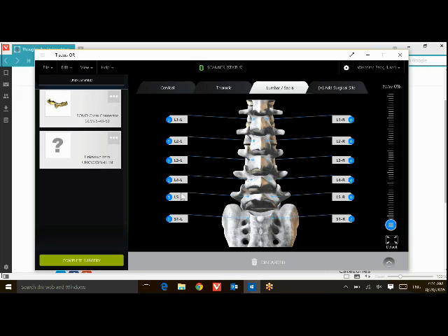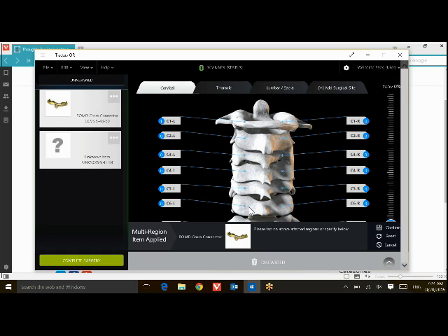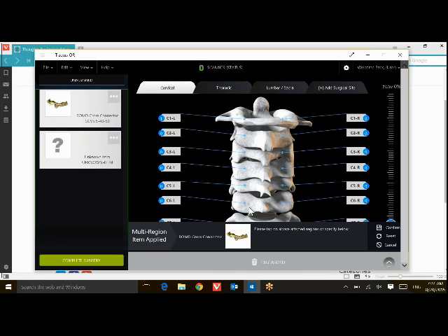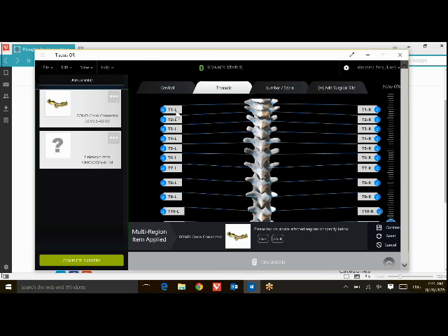And let's say that there's a multi-region item, and you're going to tell me inevitably, well, Brendan, what if we want to do, in this case, a cervical thoracic fusion with a cross connector. I know that it's not anatomically the case, but just for the sake of argument. So we can go on ahead and we can put it in multiple zones, and we can jump to additional tabs, and the software automatically keeps track of all of the zones that this item is attributed with.